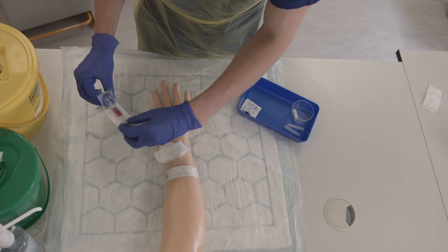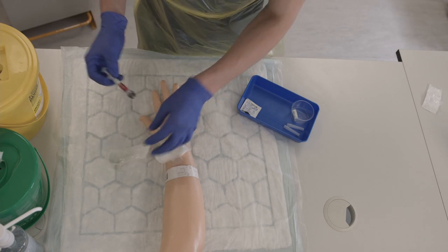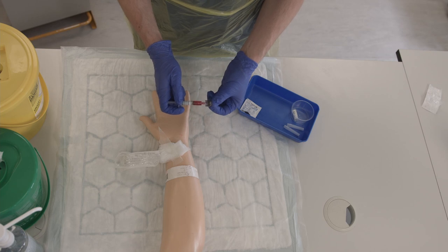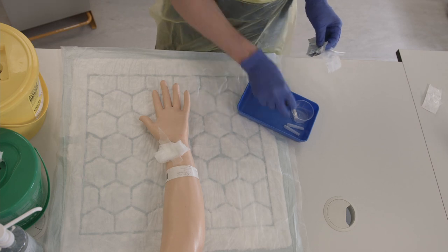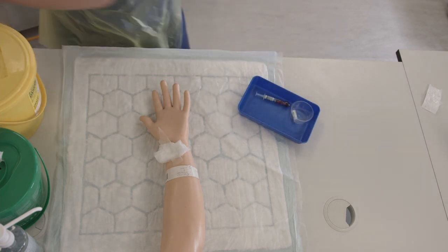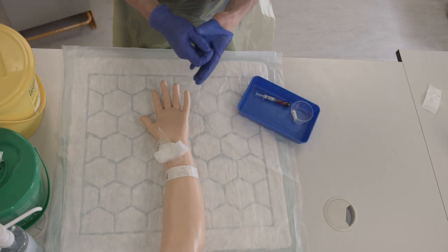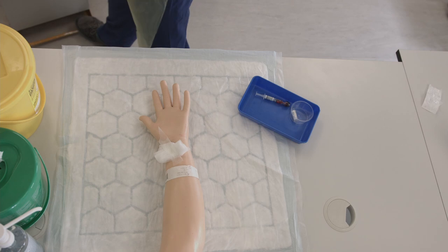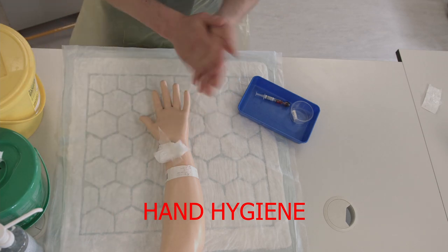Then attach the top of the syringe and fill it up with blood, then replace it back in your tray. Remove your tray and then remove your gloves using the pinch-pull technique. Wash your hands using the 7 steps of hand hygiene.